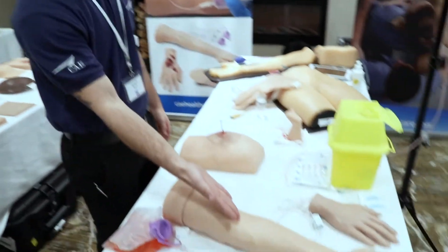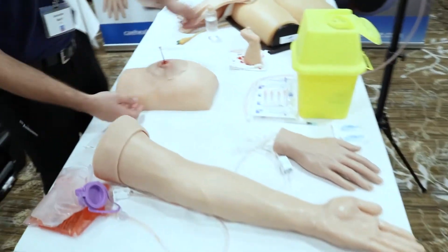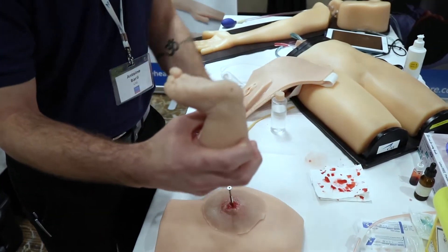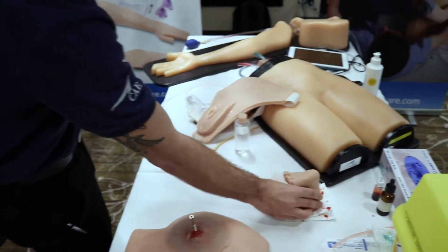We have IV arms, IV hands, and a baby foot with the heel prick test that you can get a drop out of and do whatever you want to do with it.